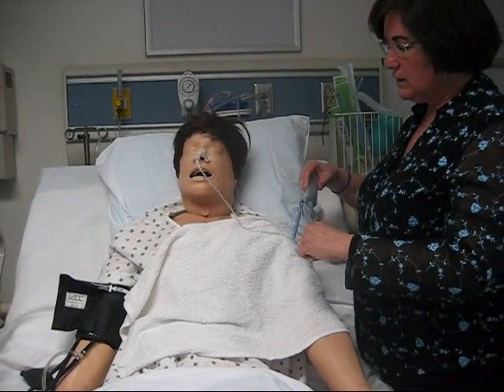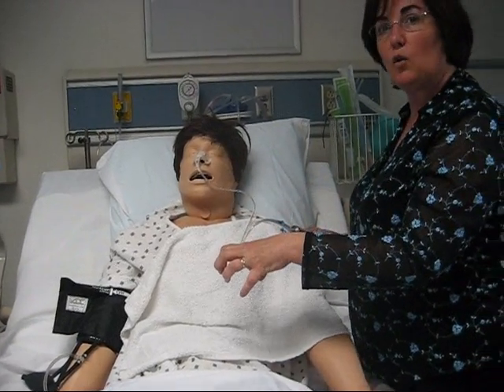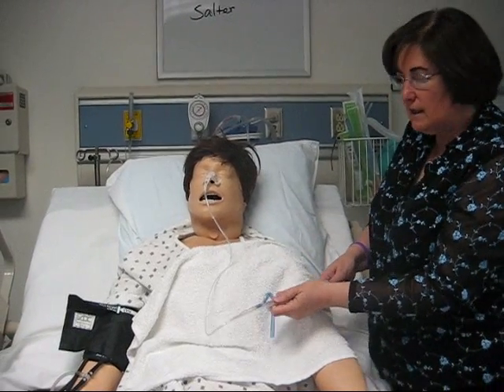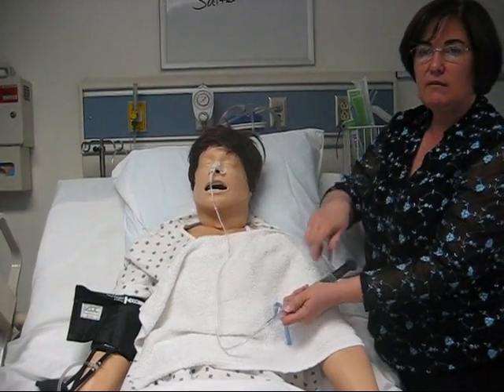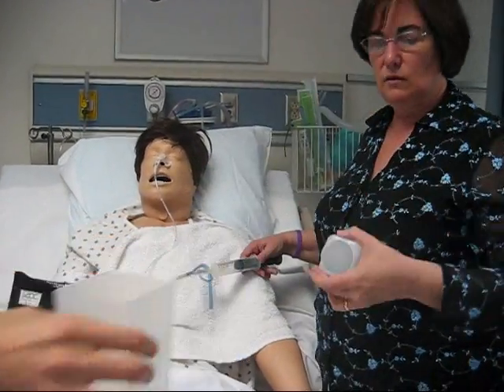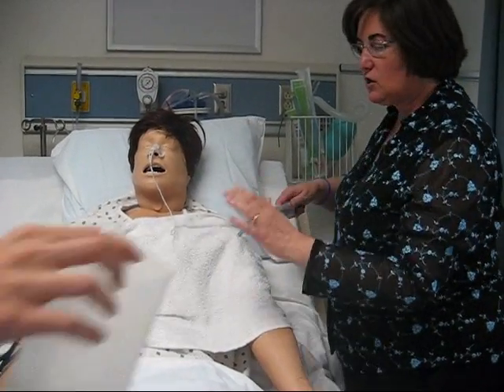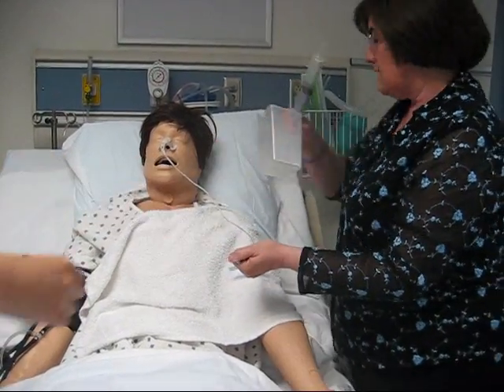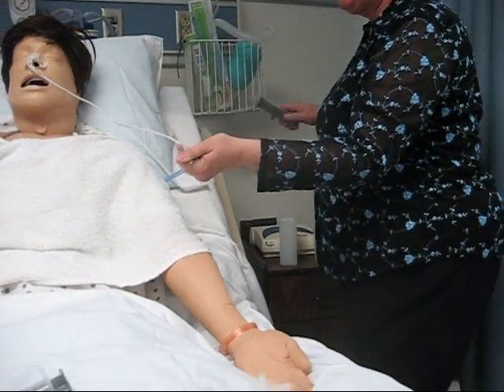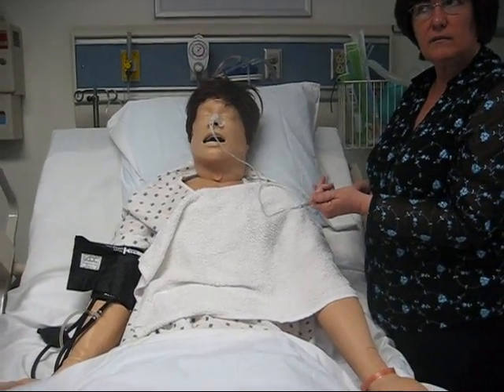And now I want to actually do that residual check that Jason was talking about. I want to see what's residing or what's left in their stomach before I add food. So I'm going to pull out everything. And let's say they have a lot. May I actually have one of those containers there? Okay, and so there's a container like this at the bedside. There's 2 of them. So I would actually, oops, this one is the water one. So I could actually crimp the tubing and put the gastric residual in here, and I would keep doing it until I got nothing. Until I got nothing, all right?